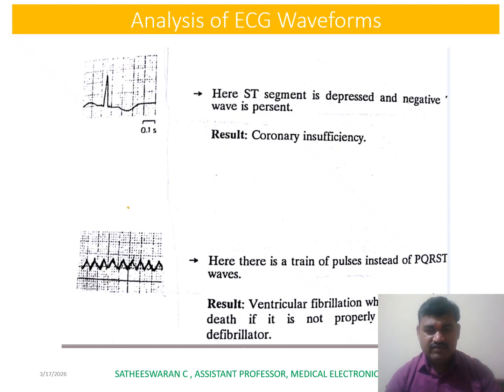Then it's a triangular waveform. Here there is a train of pulses instead of the PQRST wave. This results in ventricular fibrillation. It may lead to death. It should be immediately treated by a defibrillator.